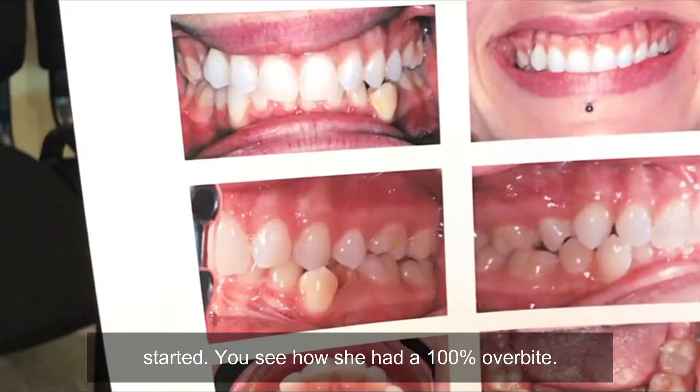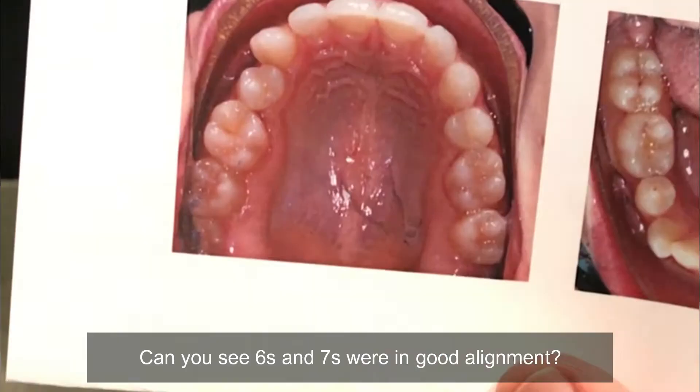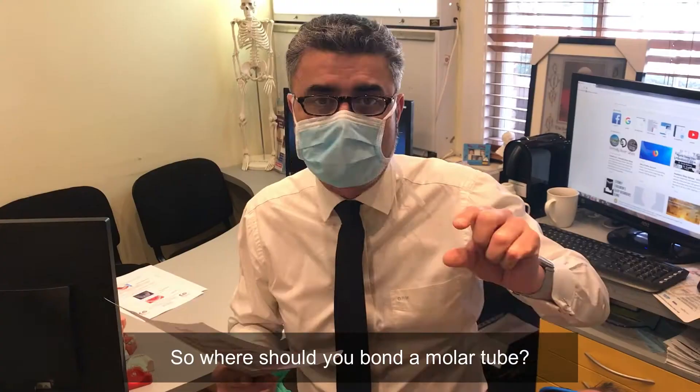Now this is where Susan started. You can see she had 100% overbite and she was very Div 2, with a high canine occlusal cant. Can you see the 6 and 7 are in good alignment? So you've got to really watch where you bond your molar tubes so you finish with them being in good rotational control.